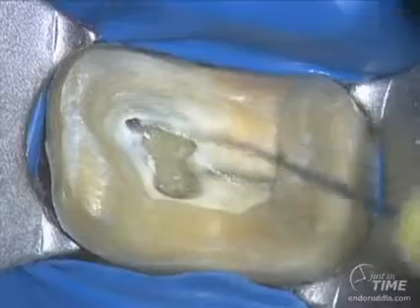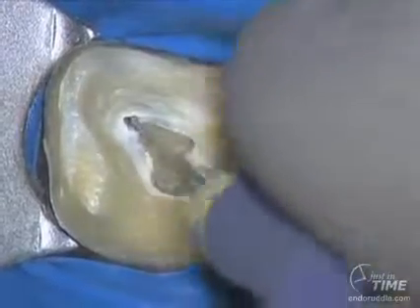That means greater control. You can see that there's lesions around the root apices approximating the maxillary sinus. So by taking this crown off, I'm going to not only have shorter instruments that I can use, but I'll have a better understanding of the emergence profile and how that tooth comes out of the free gingival margin, because I'll have unsurpassed vision of the prepared abutment. Let's take a look. So here we are immediately coming in to the MB.